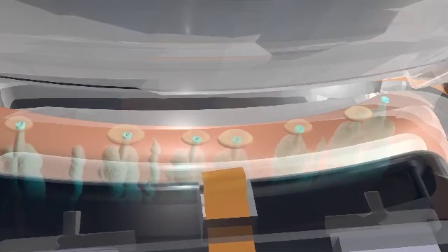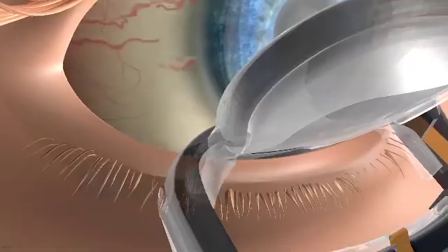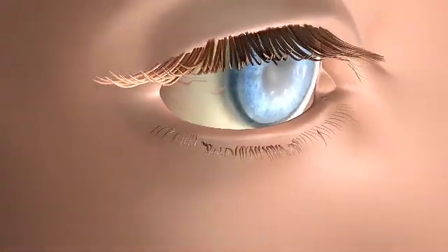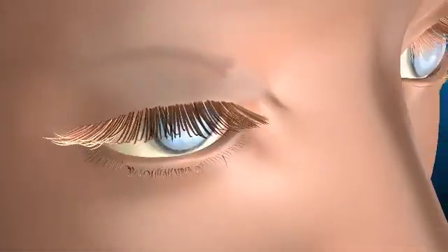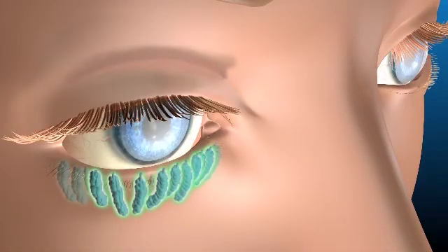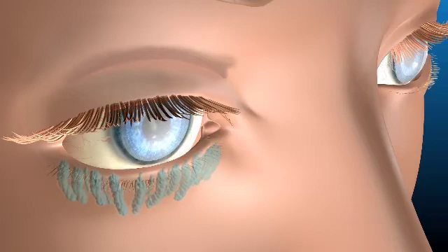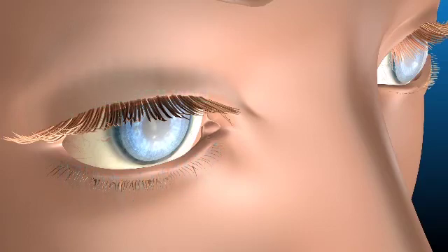Once that region of the eyelid is treated, the inner pad is removed. Another region of that eyelid may be treated if desired, or other lids may be treated with the same disposable. Note that only about eight functional glands are needed in order to establish a stable tear film. So it may not be necessary to treat the full width of the lower lids, which contain about 25 glands, and it may not be necessary to treat the upper lids, which contain about 30 glands, unless the patient has specific symptoms.